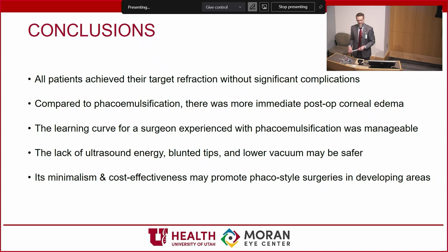It's not efficient. It's not ever going to be the path in its current iteration. Could there be something similar in the future that is developed that's portable, able to be used in 3, 4+ lenses? Possible, but as is, this isn't it. And yet, the technology is amazing. It's really, really impressive. That's doing the case right there. The machine's not in the room, so.